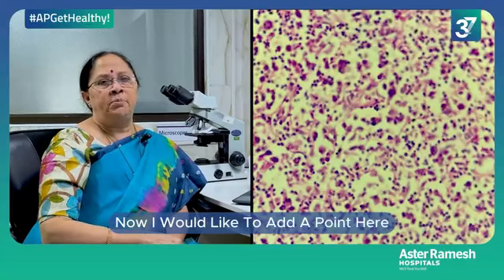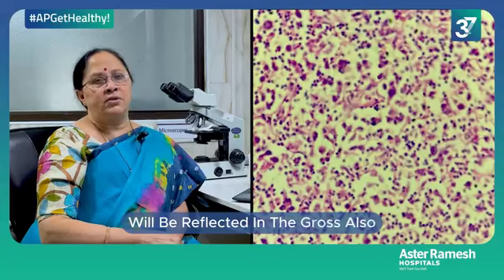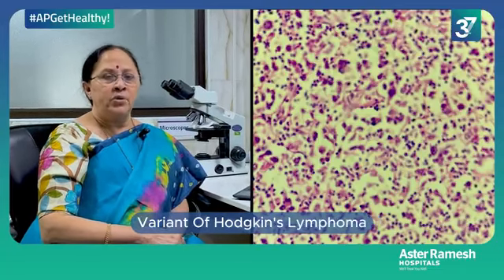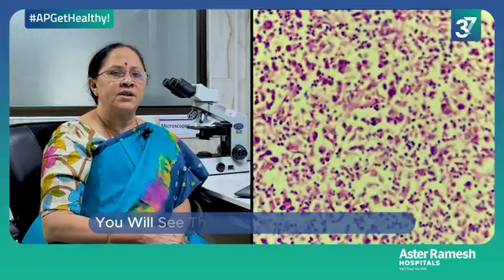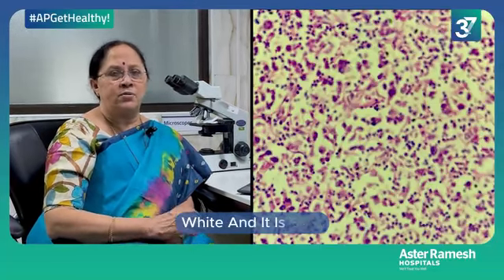Now, I would like to add a point here: whatever is the microscopy will be reflected in the gross also. If it is a nodular sclerosis variant of Hodgkin's lymphoma, or any other case where there is nodularity, grossly also you will see nodular pattern, and especially in nodular sclerosis you will see a firm appearance grossly, but in this case it is uniform gray white and it is soft.